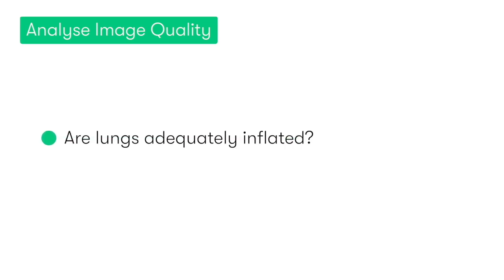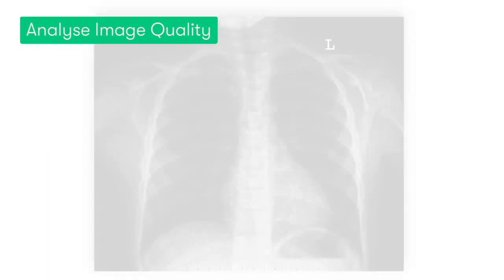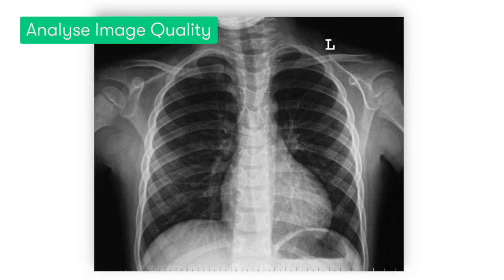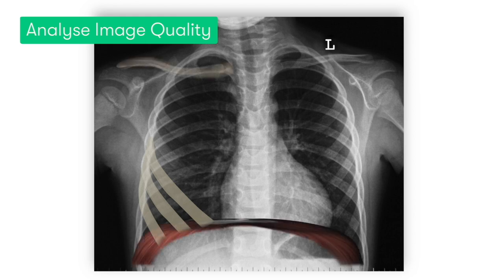The first thing to look for is whether the lungs are adequately inflated and that we are able to visualise the maximum amount of lung tissue. In an adequately inflated chest, either the fifth, sixth, or seventh anterior ribs should cross the diaphragm along the mid-clavicular line. So in this case, we can say that the chest is adequately inflated.